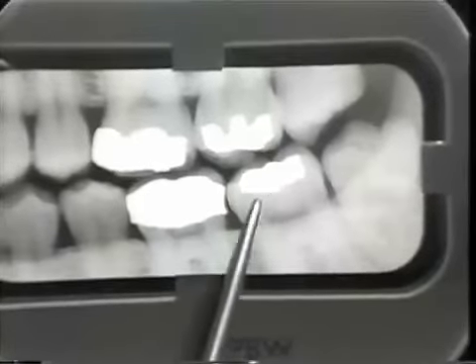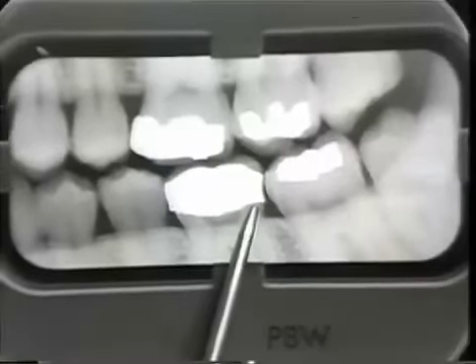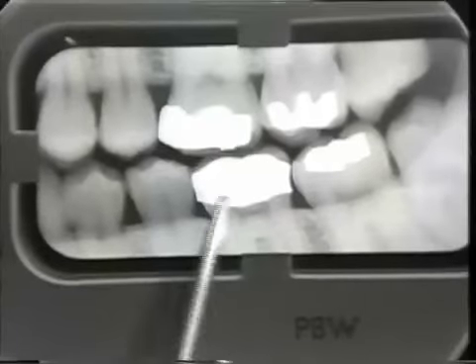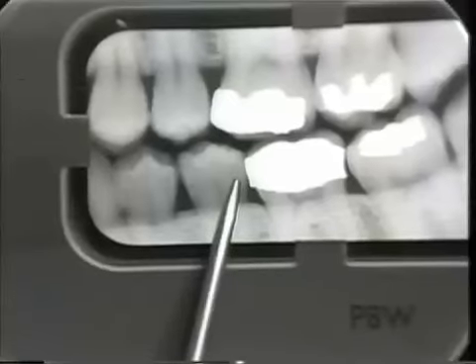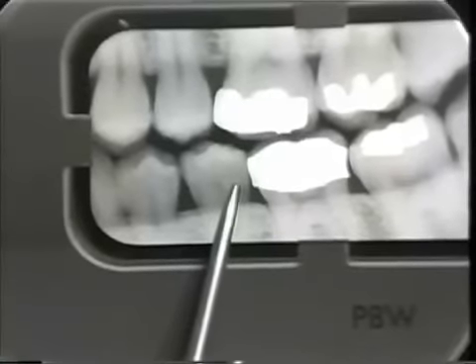18 shows a restoration, and number 19, a little heavy here on the distal cervical margin, also slightly on the mesial cervical. Number 20, surface 2, shows a carious lesion, which is through the enamel. It is evident in the dentin. And this is a situation where we would do the restoration.